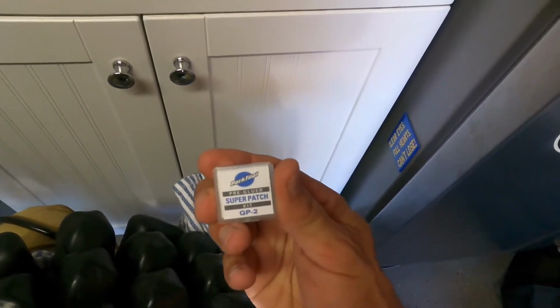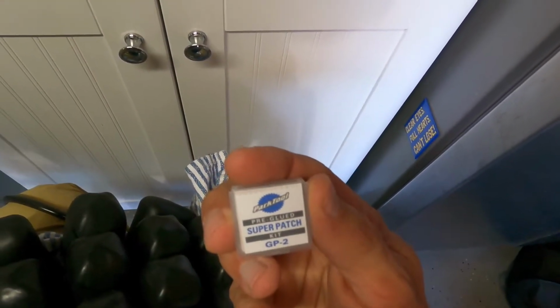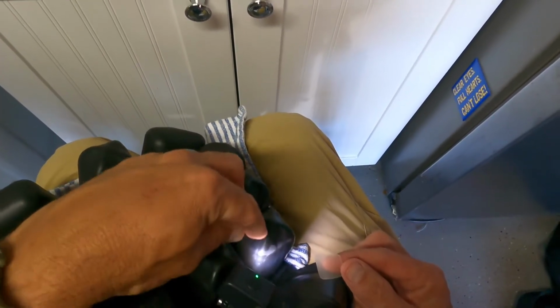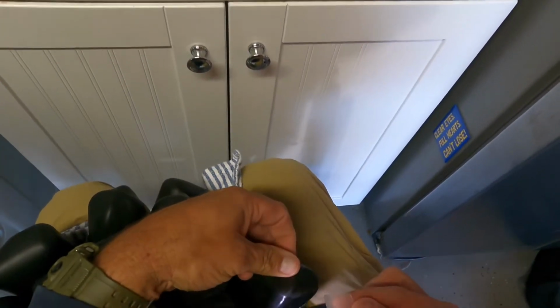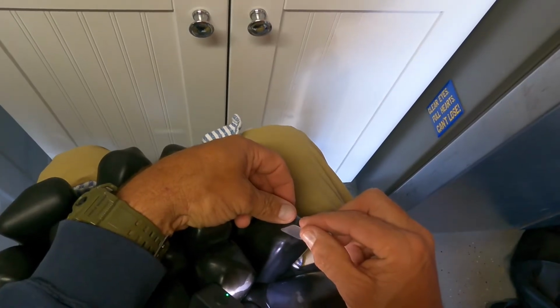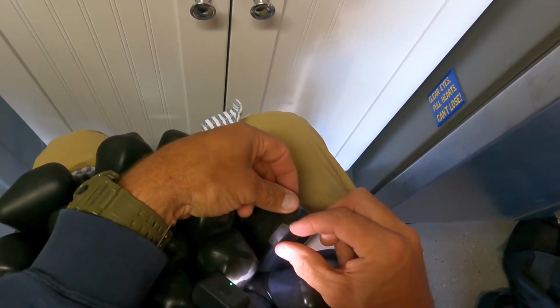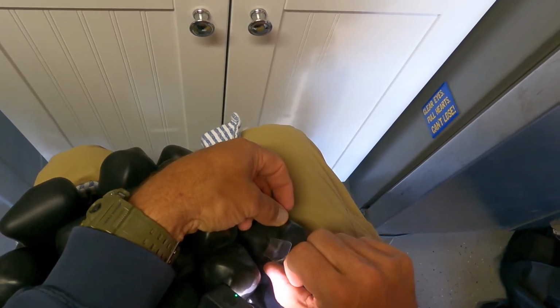What I've got to fix this is just two little patches from Park Tool. You can get them anywhere. I think Specialized makes one. It's a pre-glued patch. Okay. And so then I'm just gonna see where that hole is, right square over it.